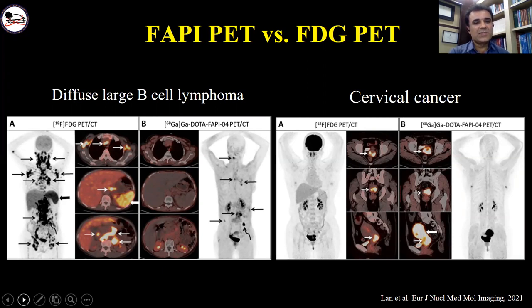For example, in this case there is intense uptake on FDG PET in different regions — head and neck, chest, and abdominal pelvic regions — while there is very low uptake in the corresponding FAPI PET-CT.